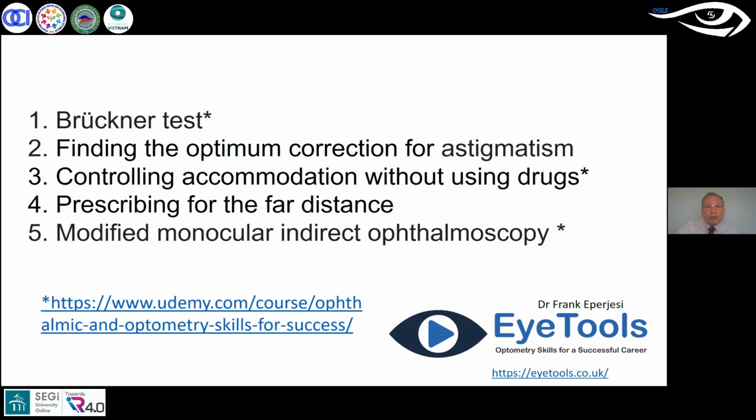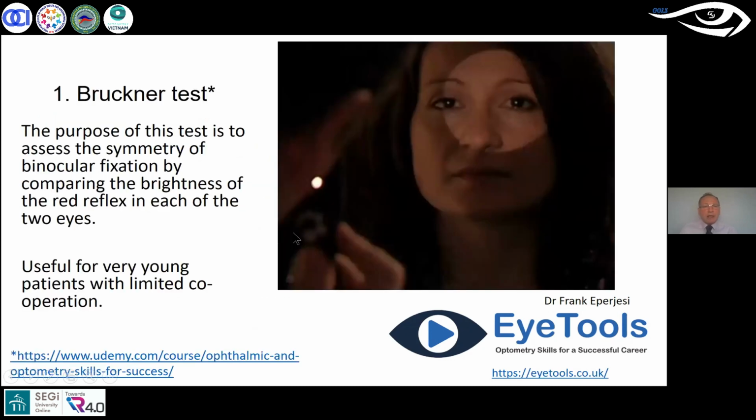Thank you. So I'm just going to move on now to the first topic, which is, there we go, the Bruckner test. Now, when I did my bachelor's degree in optometry school, no one mentioned this technique to me. Okay, it was about 30 years ago now, but no one mentioned this technique. It was only when I went to the States in about 95, 96 to my first conference, the American Academy of Optometry, that I heard people talking about this test. And I thought, well, this is a wonderful test.